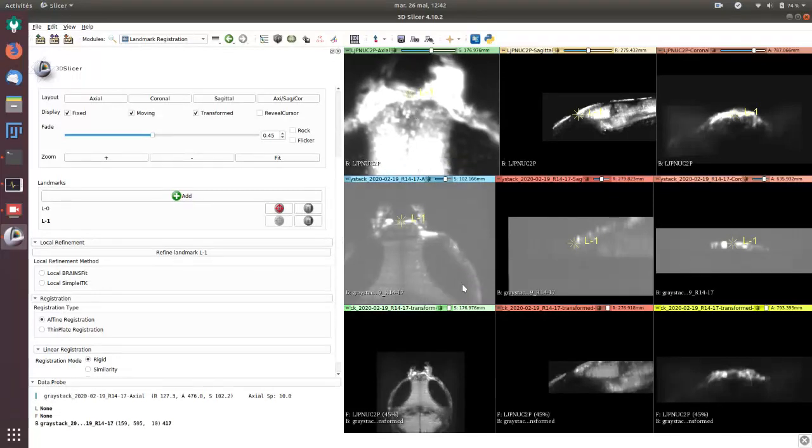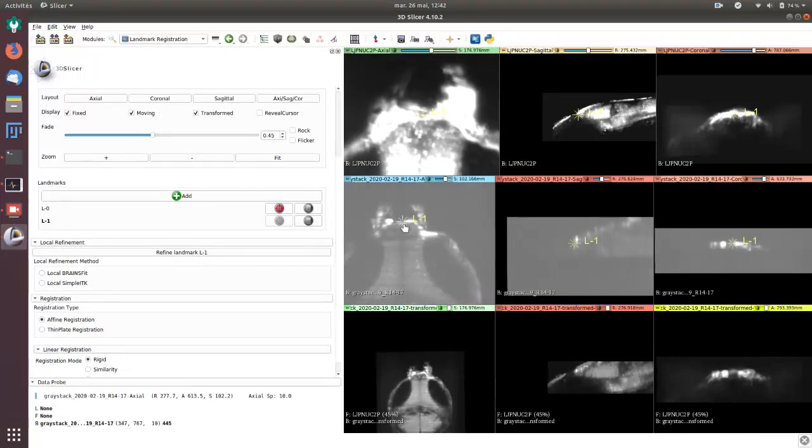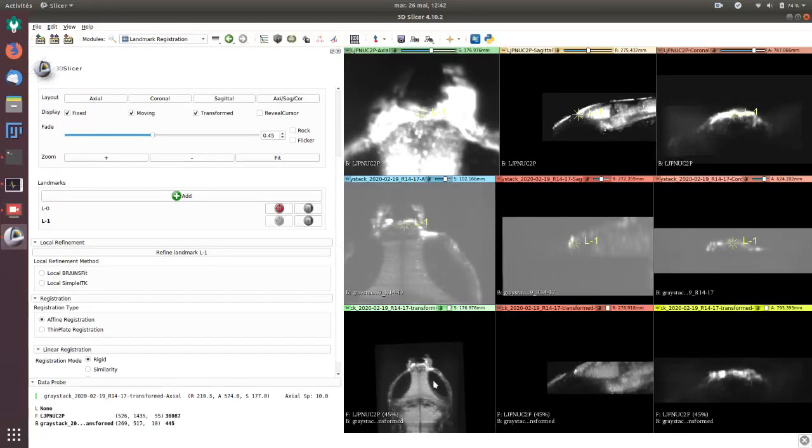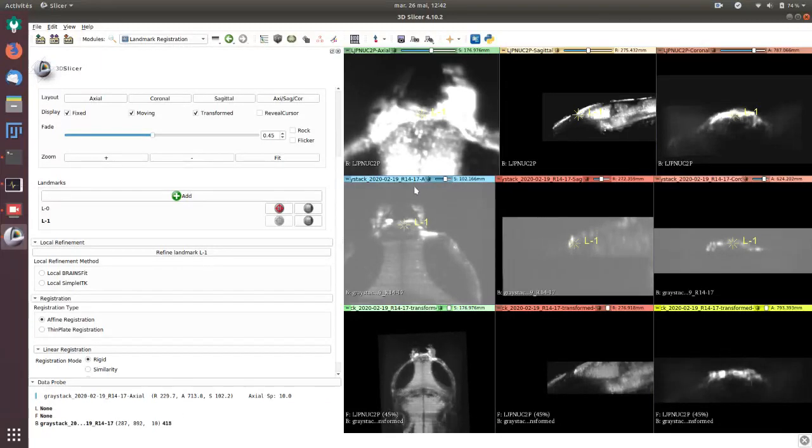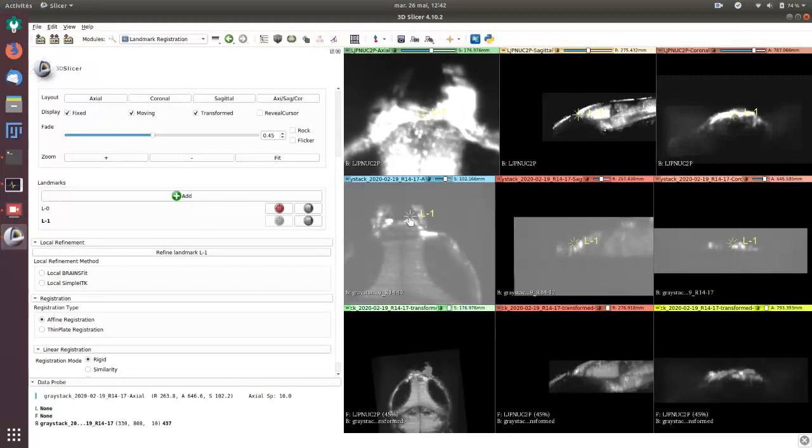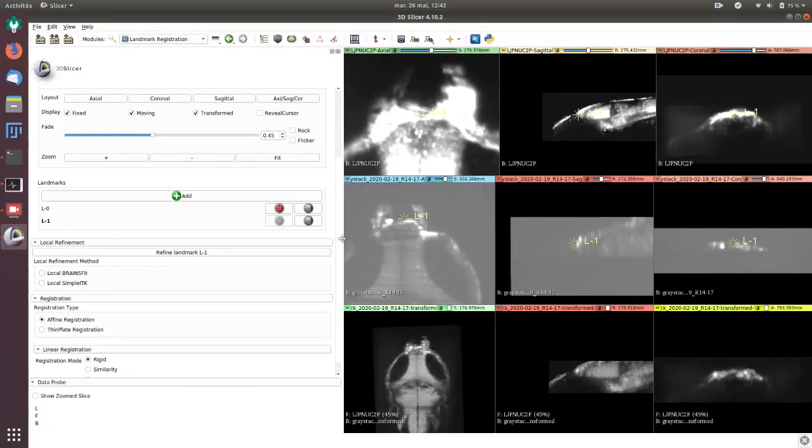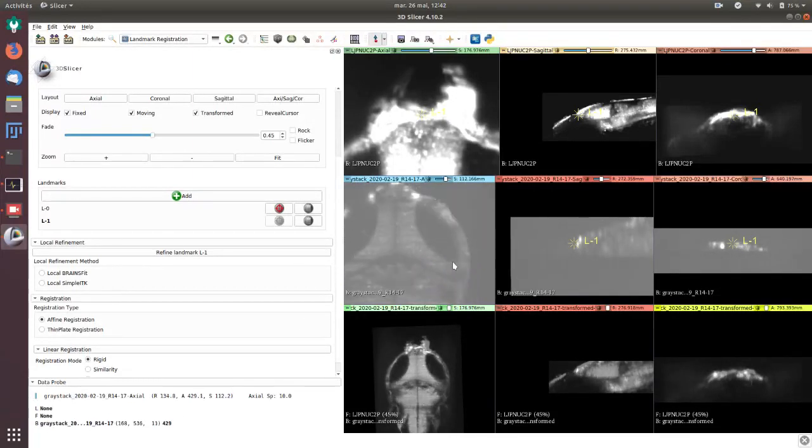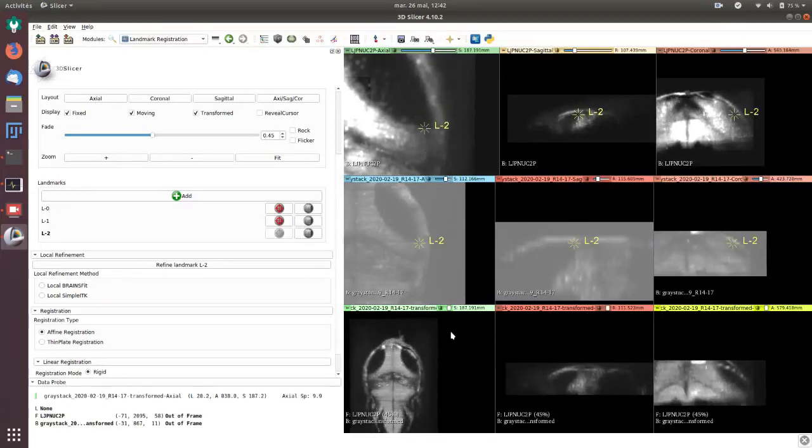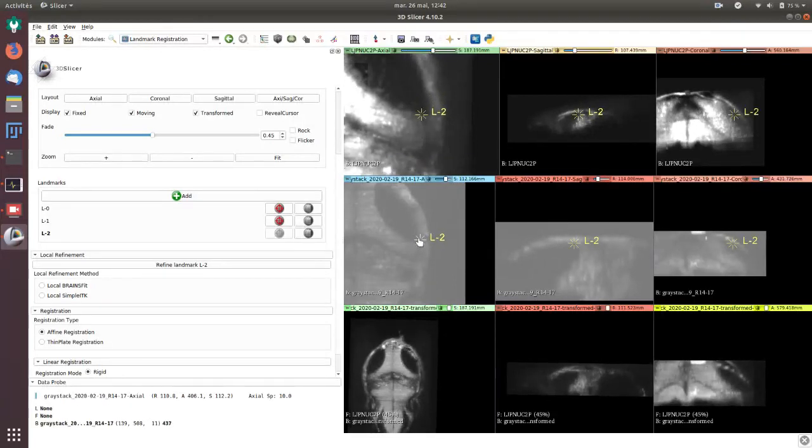Keep going. When you adjust a second landmark you see here that the brain, the gray stack, is rotating. You continue to add landmarks, for example here. It's easy to find.